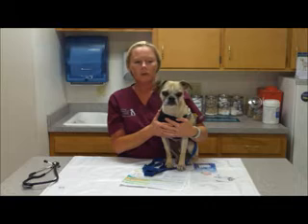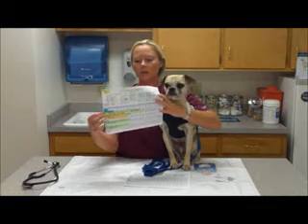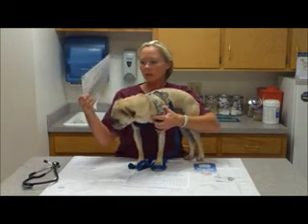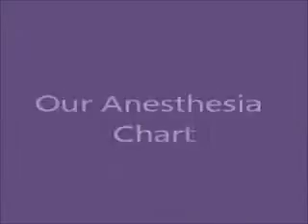So we have our monitoring form here, and I have some highlighted on where it should be during most surgical procedures, where it's concerning, and where it is really bad. So I will show a close-up picture of that so you have a better idea of what's on there. Our forms only have the pulse ox, the temperature, and the respiratory rate as monitoring parameters.